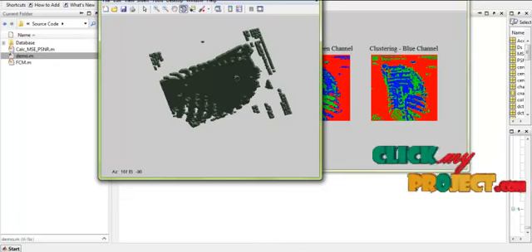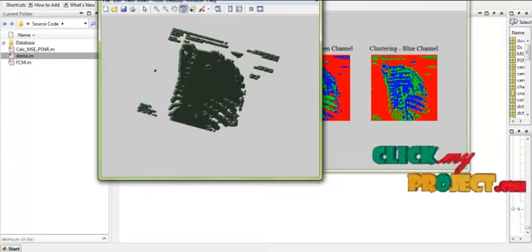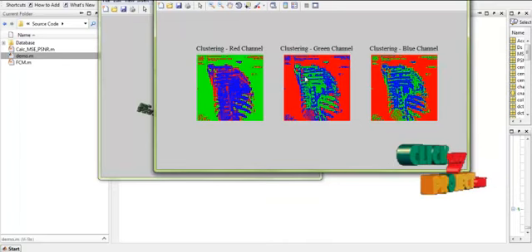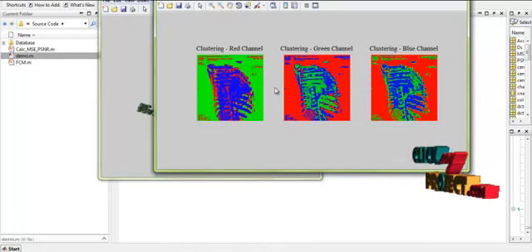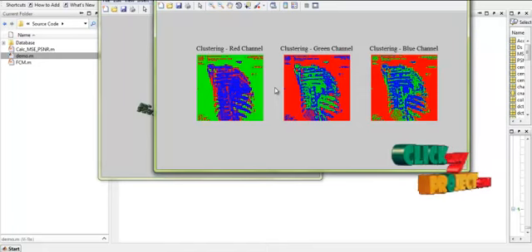Thus we have segmented the objects in the images, and we have displayed them in 3D viewing based on the clustering employed using kernel based fuzzy C-means. This process is applied for color images. So for any type of color images, this process can be employed.